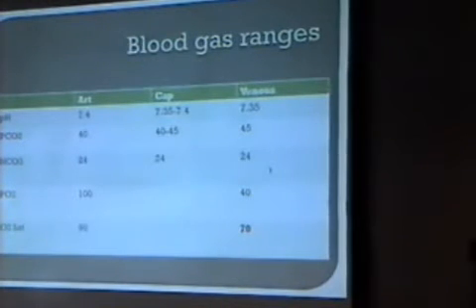Okay? So clear the difference, and when you do venous, actually PO2 in the venous reflects the oxygen extraction rather than the oxygen on the arterial side. It's both oxygen on the arterial side and oxygen extraction. So if you have very low O2 in the venous and a normal arterial, you have high metabolic rate and you have high extraction.